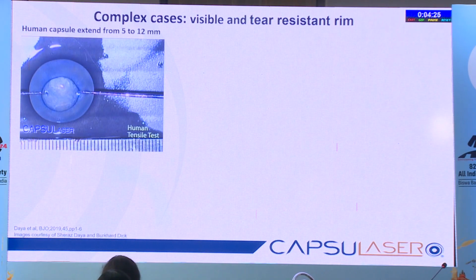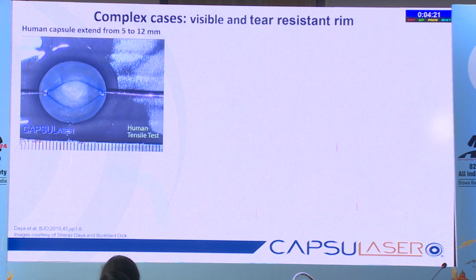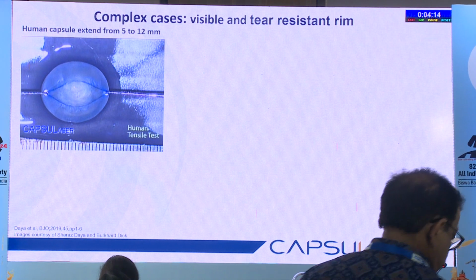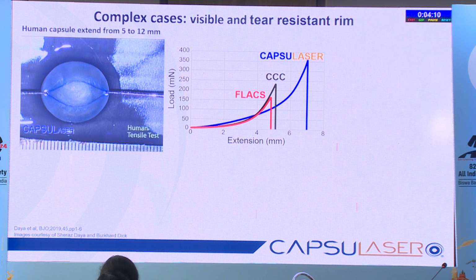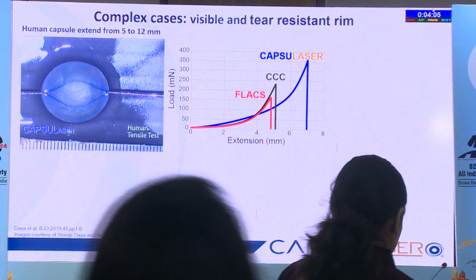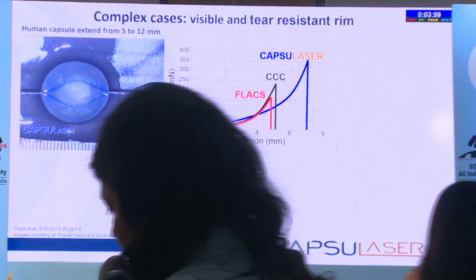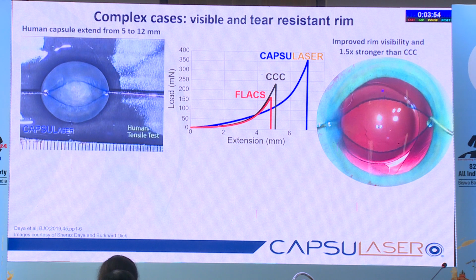So the strong capsulotomy edge: we see a cadaver eye here, lens capsule. The dark blue edge is indeed the capsulotomy, and we can see it stretched almost white to white. If we look at the strain gauge calculation here, we can see that a 5 millimeter capsulotomy is stretched to 12 before it ruptures, but if we were doing manual, it would only stretch to about 10. So these are the strain gauge curves that are based upon the measurements.